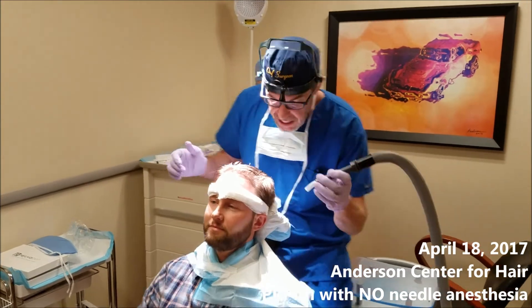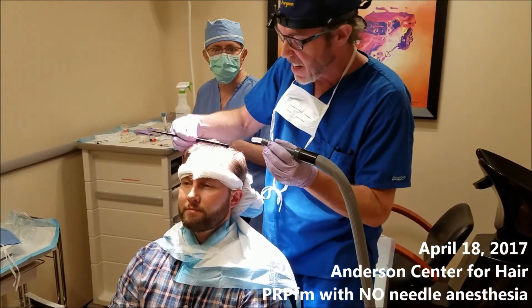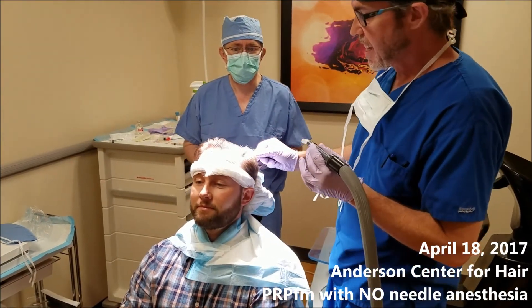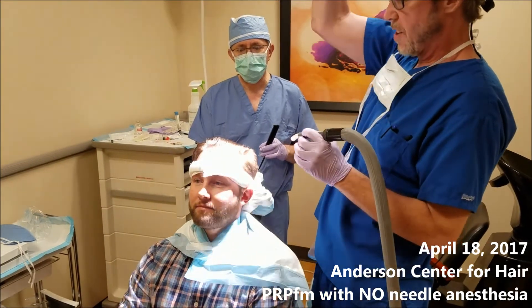We're on the other side, we're about halfway done. You're doing okay? Yeah. This is really, really neat.